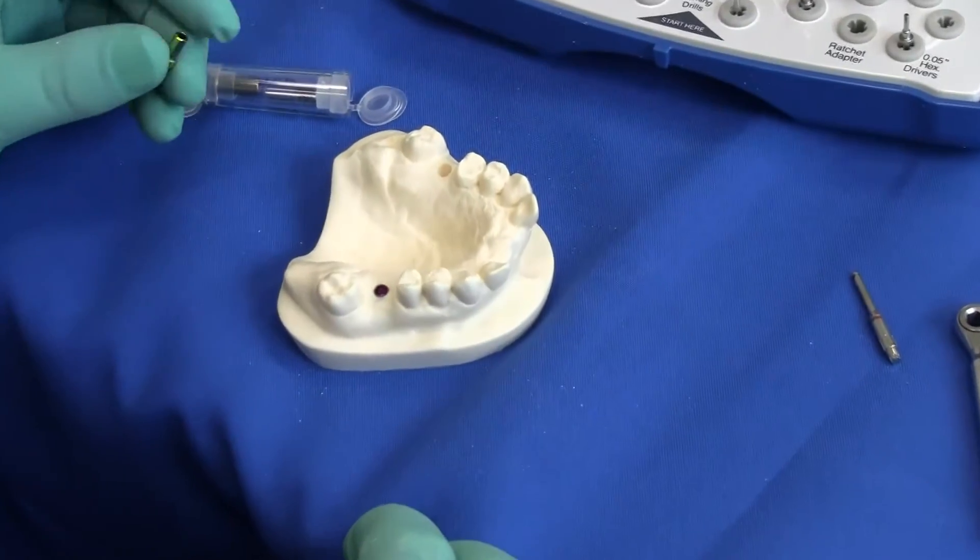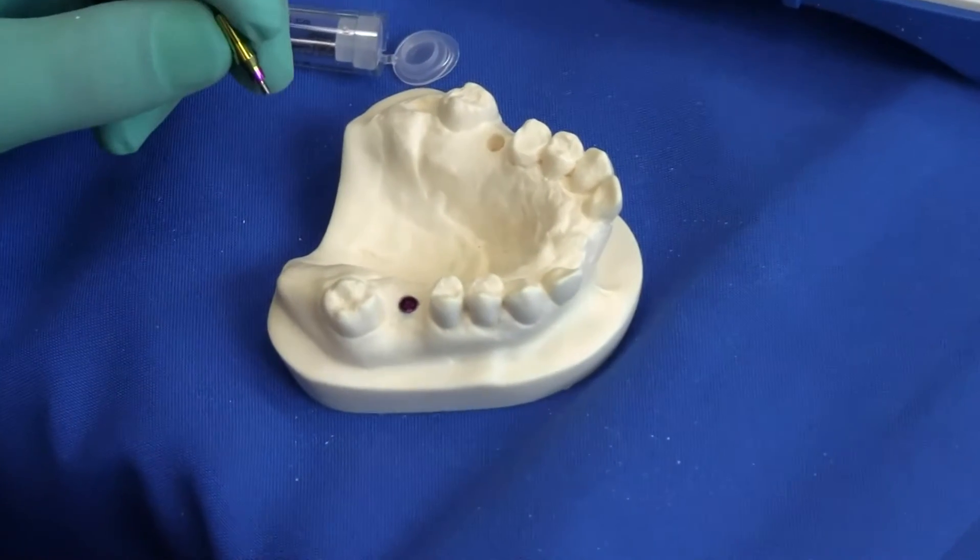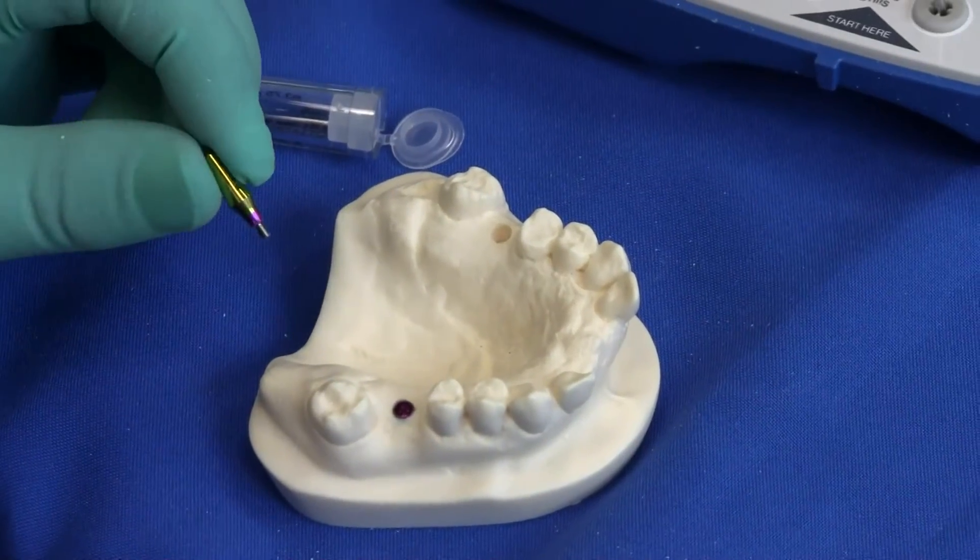Because it is a defining feature of the C1, I'm going to demonstrate its platform switching by putting on one of our abutments.